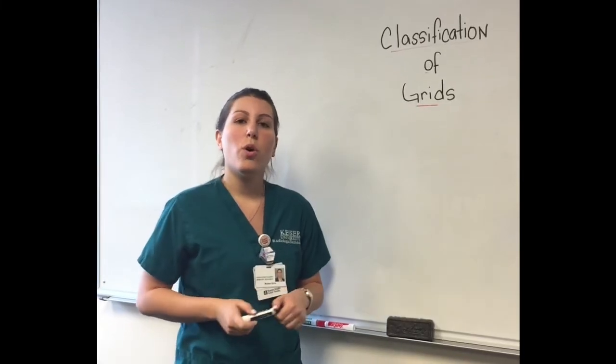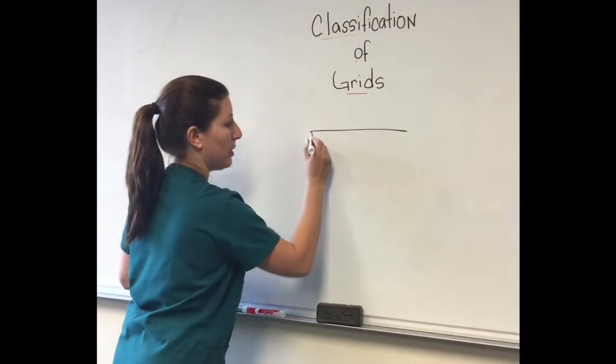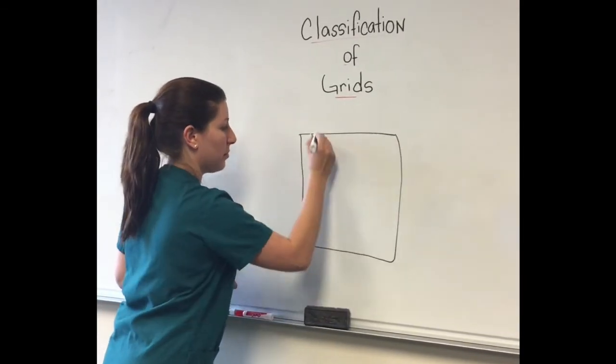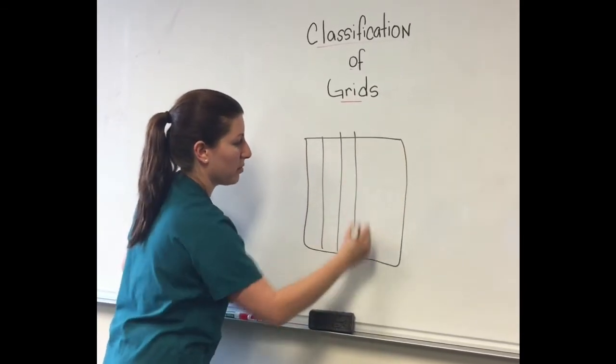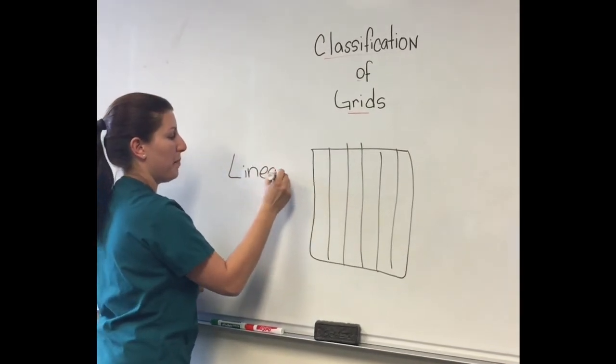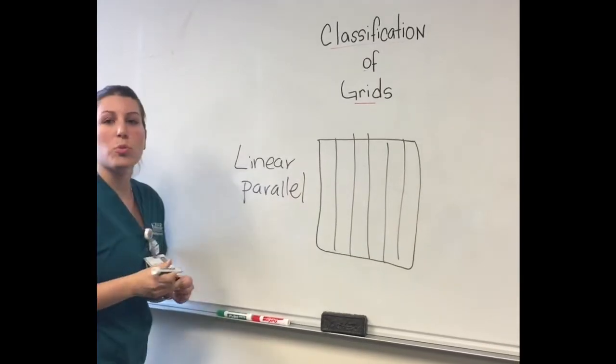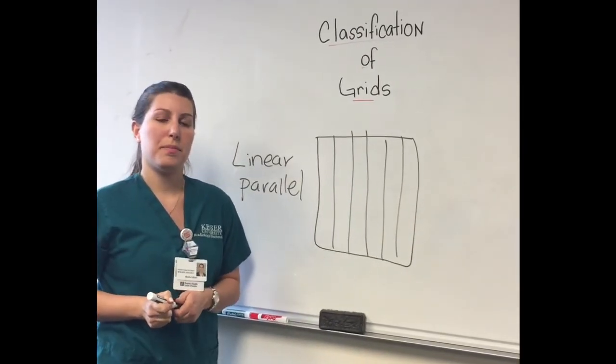The next one I'm going to go over is the linear parallel, which looks something like this. This is the linear parallel. And basically in this one, the lines never intersect.